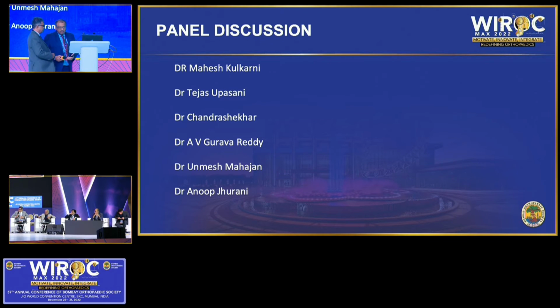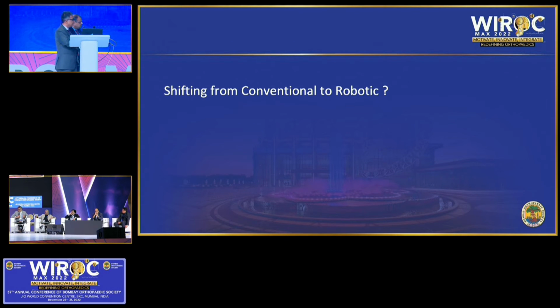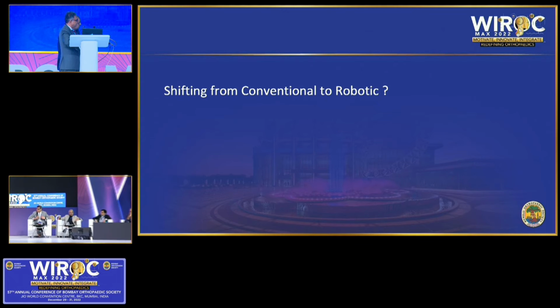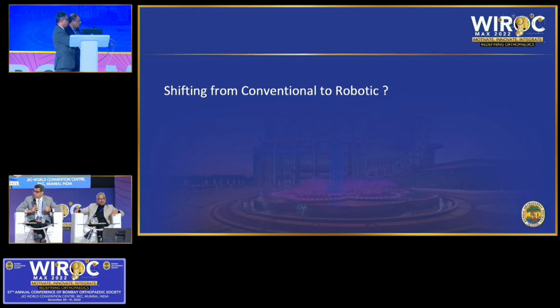From being a big skeptic of robotic systems, because I thought it was mainly based on marketing, the pandemic helped me in observing a hip replacement being performed by an American surgeon. I saw it on Zoom, and I was really gobsmacked to see the precision with which the hip replacement was done, and the speed of surgery. I was a complete convert after actually watching a hip replacement rather than a knee replacement. The conversion happened because of getting answers to the questions that I had about a hip replacement: restoring offset, length, getting the spinopelvic conundrum solved. All of these stimulated me to look at robotics in a fresh way.